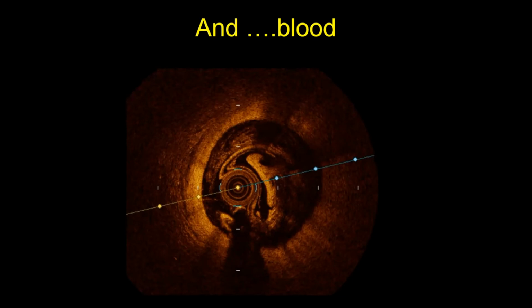And Shazia, the same thing I have heard from some of the colleagues who have more experience of OCT, the younger ones, and less with IVUS, that they struggle to get good IVUS images. But I think both of these things can be improved in terms of IVUS acquisition or OCT acquisition.